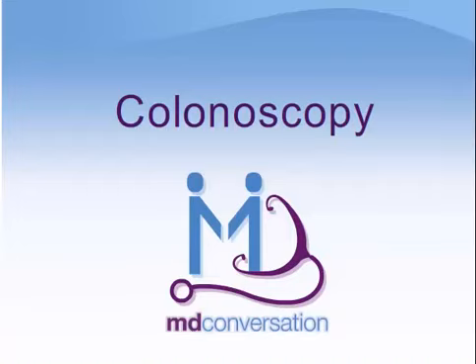Welcome to MD Conversation. This module discusses an overview of a procedure called colonoscopy. This information is taken from a recent review of the medical literature.